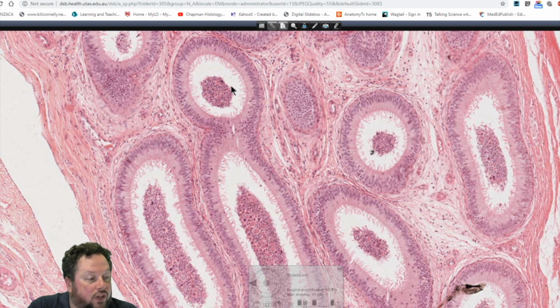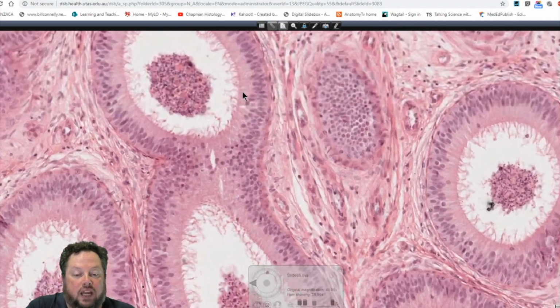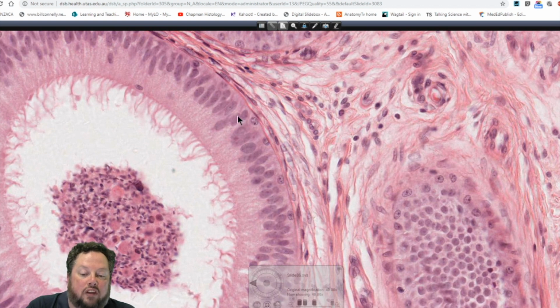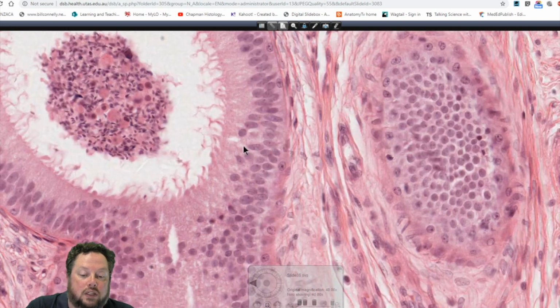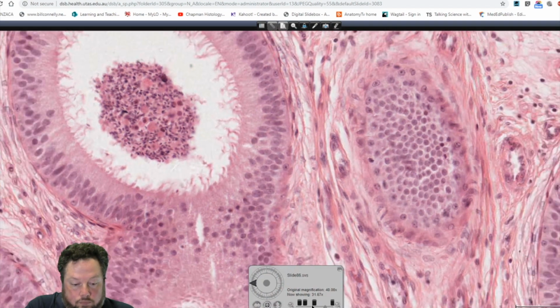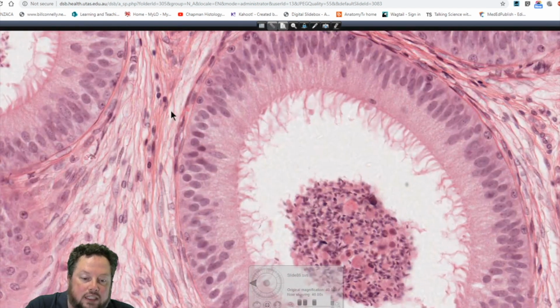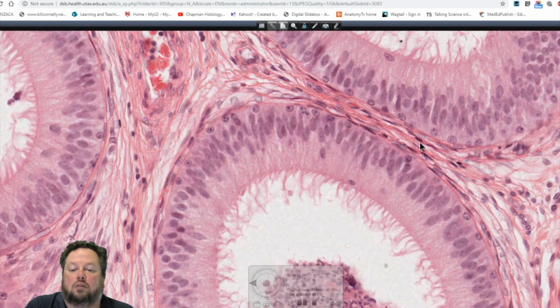Epididymis has stereocilia, microvilli, or both. It's predominantly stereocilia. The cells which have the stereocilia are referred to as principal cells. They're the columnar cells. We also have basal cells, of course, which are stem cells which replace these principal cells. But primarily it's just the stereocilia that they have. So there is some smooth muscle in the wall on the outside here. Initially that's just 1 to 2 layers, but then by the time we reach the tail end of the epididymis, it actually gains a 3rd layer, which is then continuous with the 3 layers of the smooth muscle of the ductus deferens.